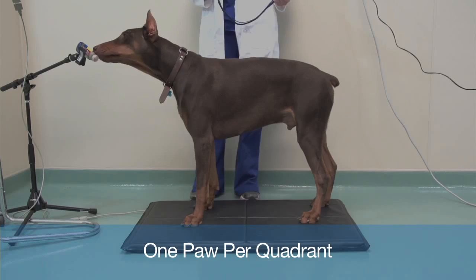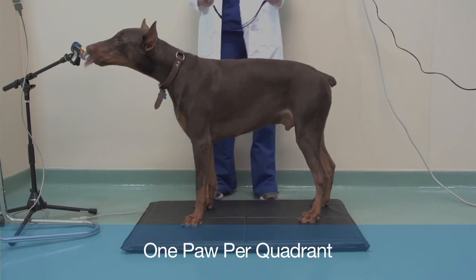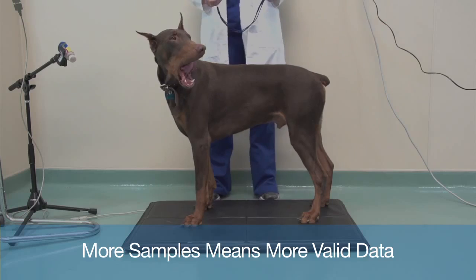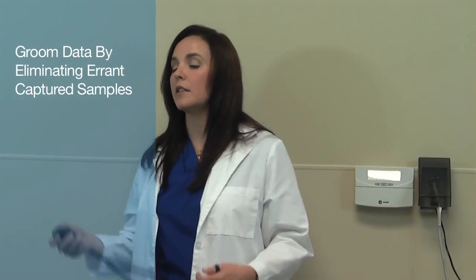This is Dexter, and as you can see, he's standing squarely with all of his feet in all four quadrants. I'm going to capture some data samples that will give me the percent weight-bearing readouts of each limb. I'm going to use my handheld remote and capture as many samples as I feel necessary. He's standing pretty stable, getting some pretty good samples here. I don't have to worry if a sample isn't any good because I have the ability to delete the sample.